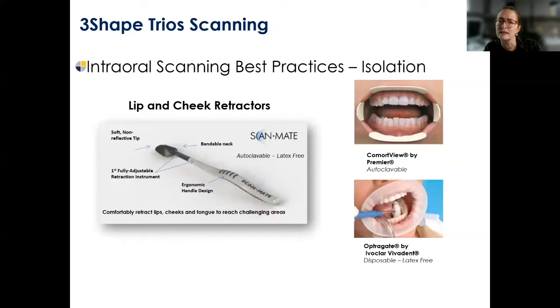As a best practice, I like to revisit, especially when it comes to removable type scanning where there's some missing dentition and retracting the lips and cheeks can be a little more cumbersome, the use of some sort of lip and cheek retractor. The Obturgate in the bottom right-hand corner is disposable. The one directly above that, the Comfort View, is autoclavable. Both work very nicely and are pretty comfortable for the patient, with good patient compliance.